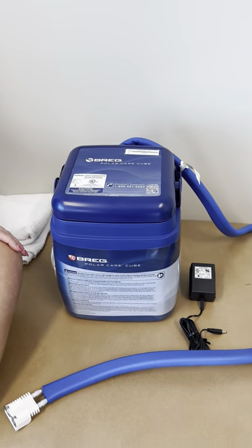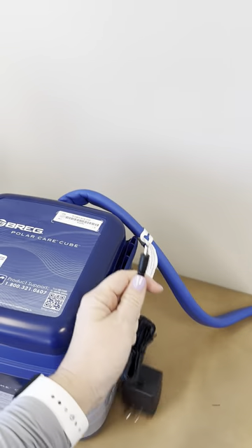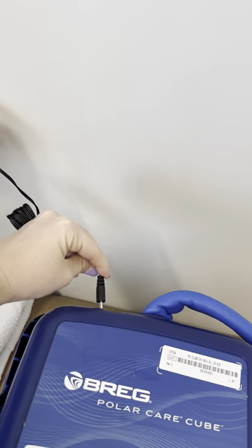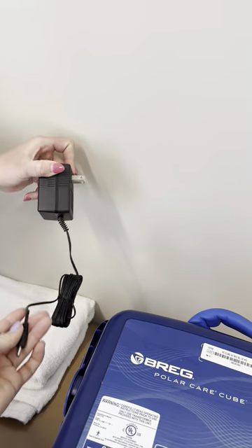On the unit, you will take the plug-in — this small adapter — and it will plug into the back of the unit, about here, and then you will just plug this into your wall.